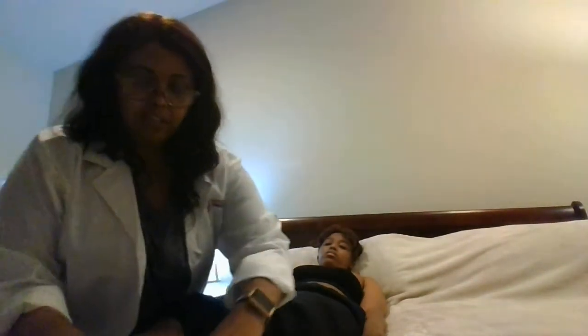And then I would check the other leg. Did I do the pulse over here? Very good. That one's easier. And then check the pulses over here and check the capillary refill. I'm not quite sure if I did the pulses, look for her aortic, where's my stethoscope?